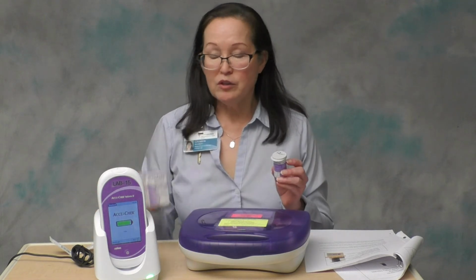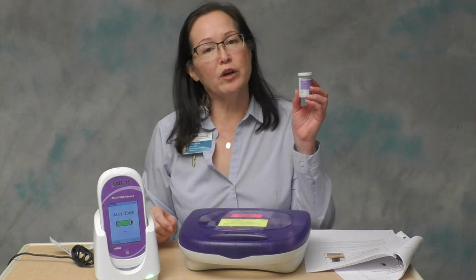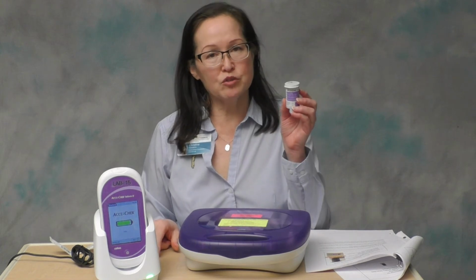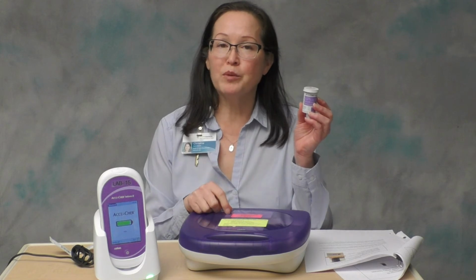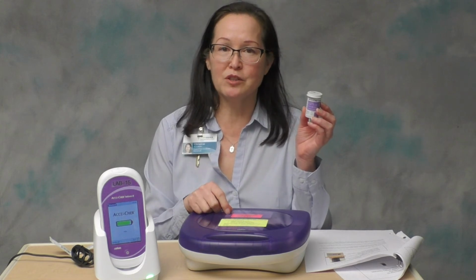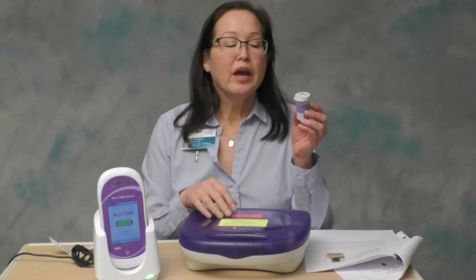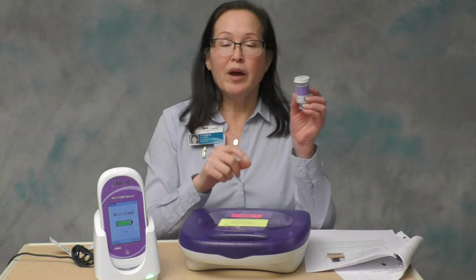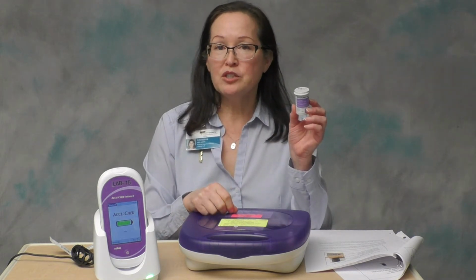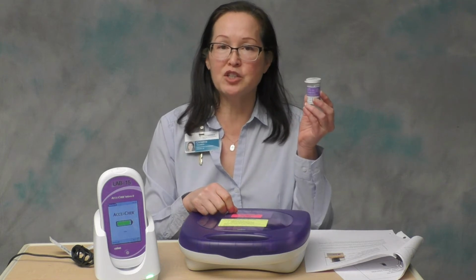So when you receive a new vial of test strips, or if you open a new vial of test strips, the very first thing that you're going to do is run quality control on your test strips. This is how we check our reagent to make sure that the reagent is performing correctly and giving us accurate test results. Once you've performed QC, and you need to run both levels of QC, you need to document that you've run QC by writing QC check on the lid of the vial. This way, anybody that grabs that vial of test strips to run a patient test knows that QC has been done and these are safe to use on patients.